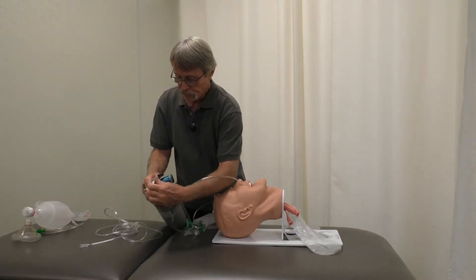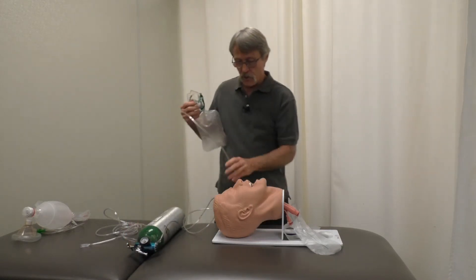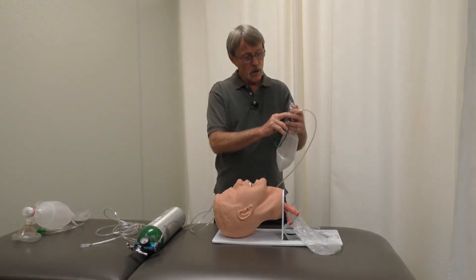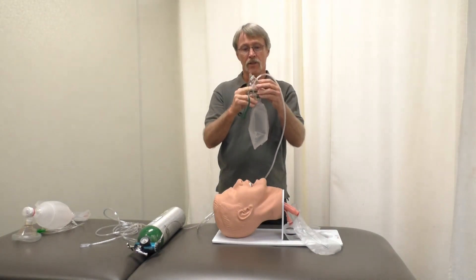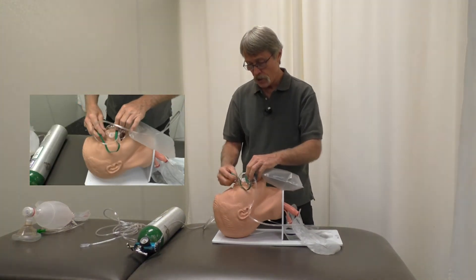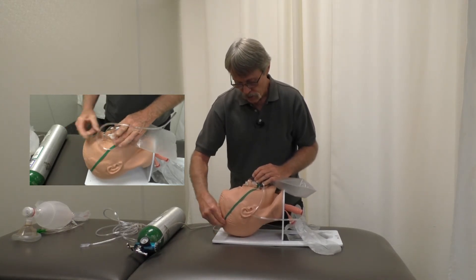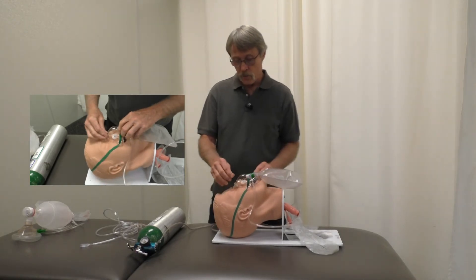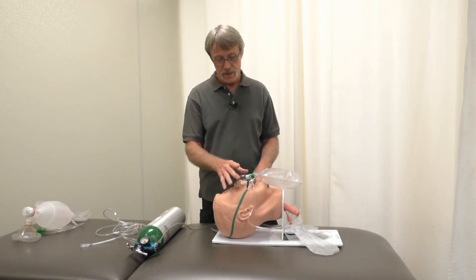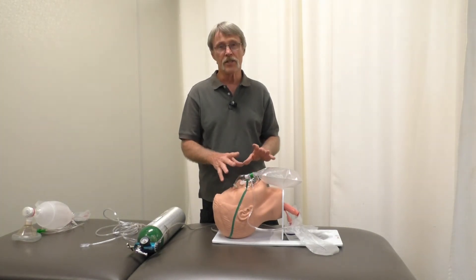Turn it on — this is anywhere from 10 to 15 liters. One very important thing is you need to put your fingers over the valve to inflate the bag until it's at least two-thirds full. Once you've done that, place the mask over the patient's nose and mouth and loop the strap over their head like that. Be aware that some people can be claustrophobic and this might really distress them, so monitor your patient, but if they can tolerate it, this is okay.